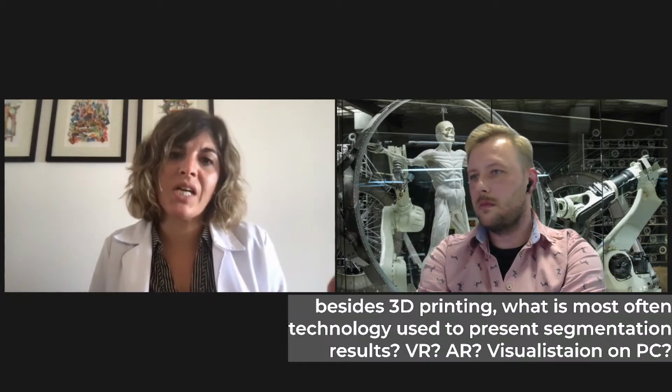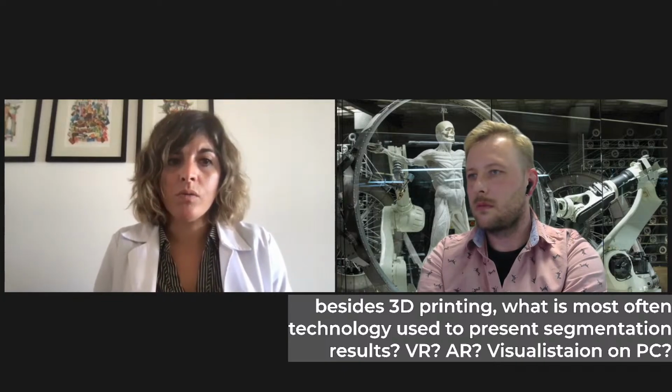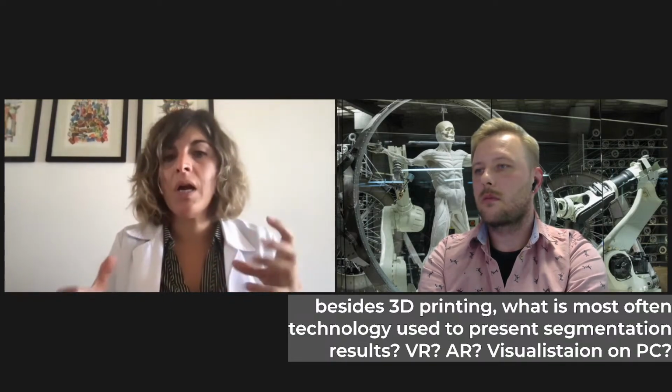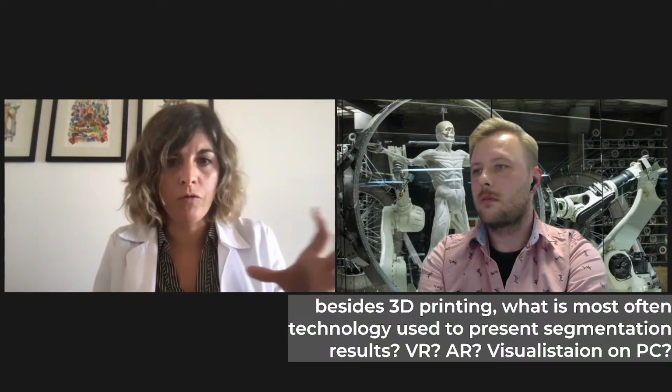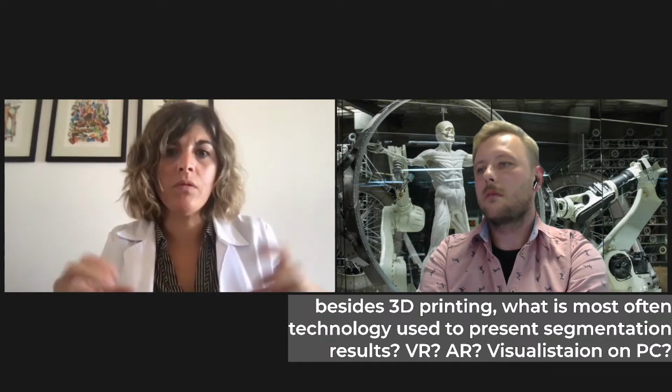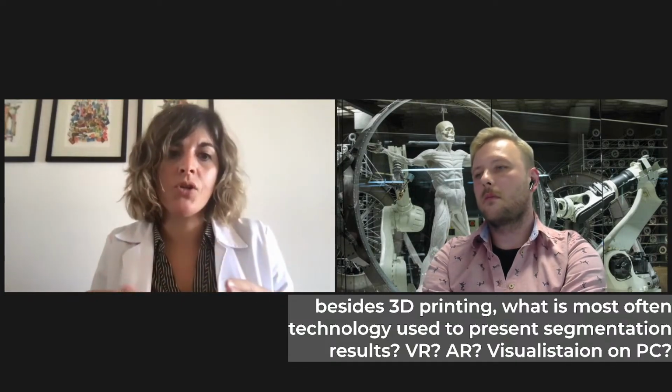Or what we also do, when we know there's not much time, is prepare videos ourselves where we show, like I was showing you the 3D view here, what the surgeon needs to know, like the relation with the tumor, with this vessel or that bone or this structure. We just make videos, which we then send them in MP4 format, so they can look at the model and even have it available in the surgical room on a screen with the information in focus.